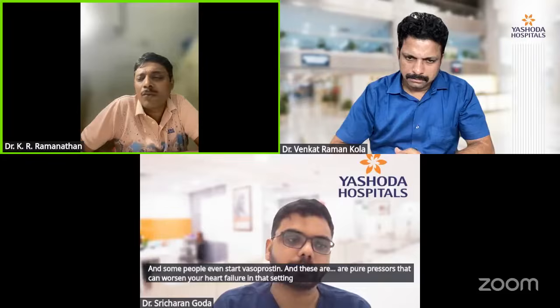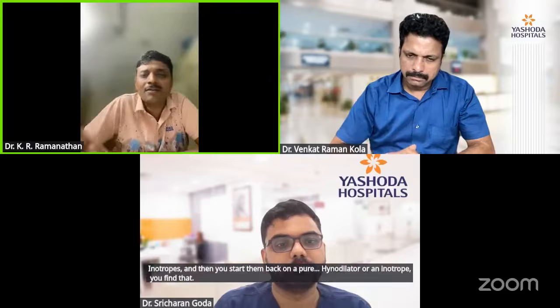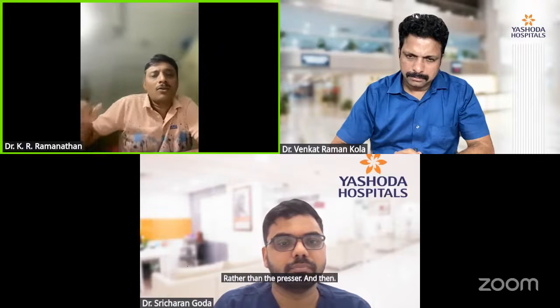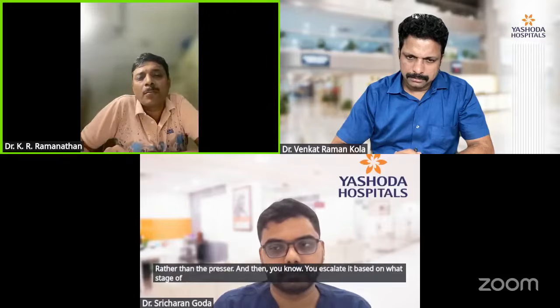So you end up going on ECMO just to swap inotropes, and then when you start them back on a pure inodilator or an inotrope, you find that things change quite dramatically. So a lot of this management should happen early, with judicious use of the right trope rather than the pressor, and then you escalate based on what stage of shock your patient is in.